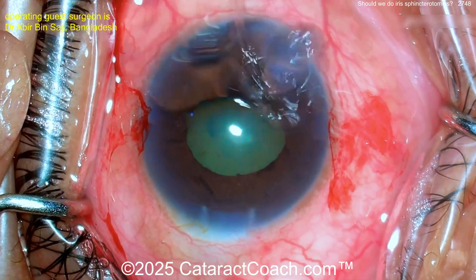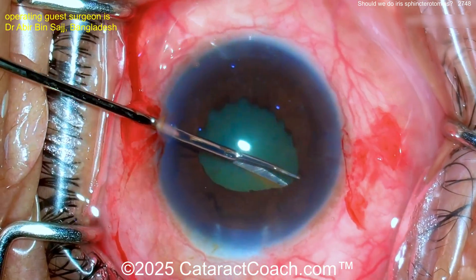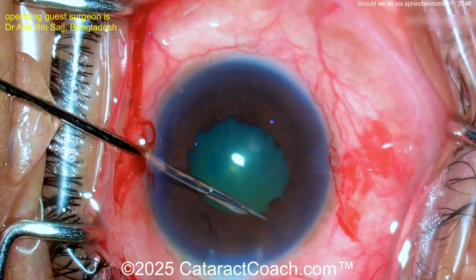These sphincterotomies — look at that — help dilate the pupil. You can go through the paracentesis, then go the other direction and do a full 360. Now I really don't think this is a great technique in all cases.